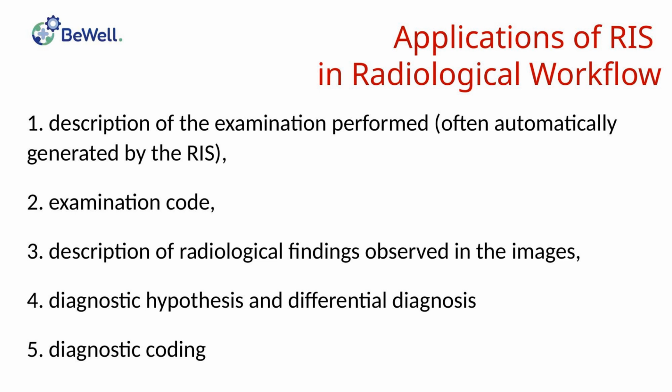The report typically includes: 1. Description of the examination performed, often automatically generated by the RIS. 2. Examination code. 3. Description of radiological findings observed in the images. 4. Diagnostic hypothesis and differential diagnosis. And 5. Diagnostic coding.